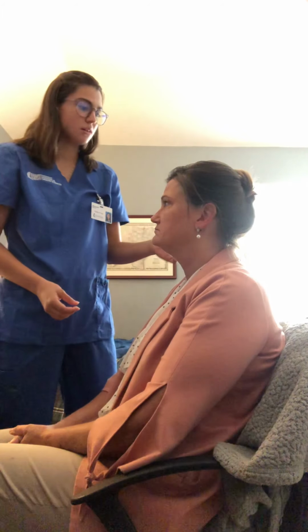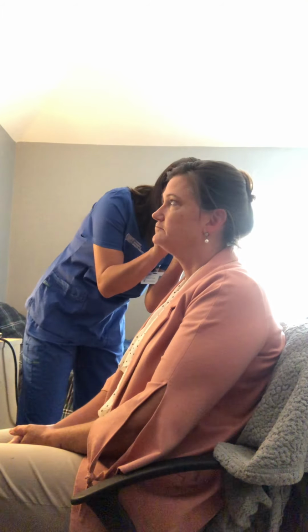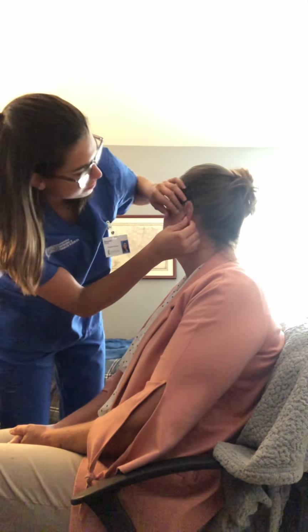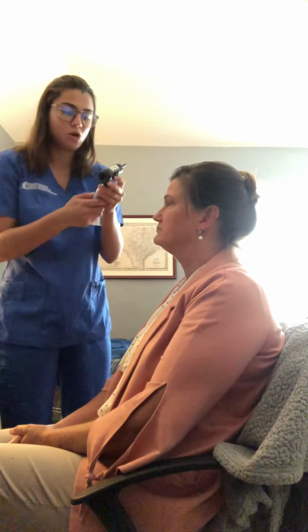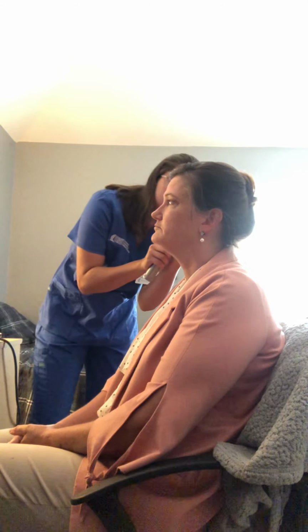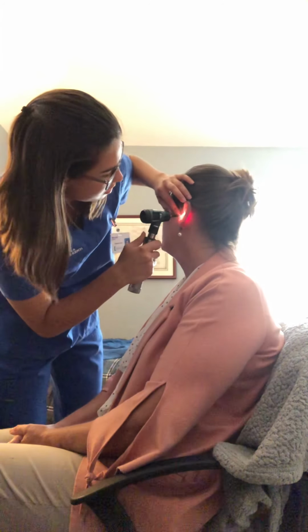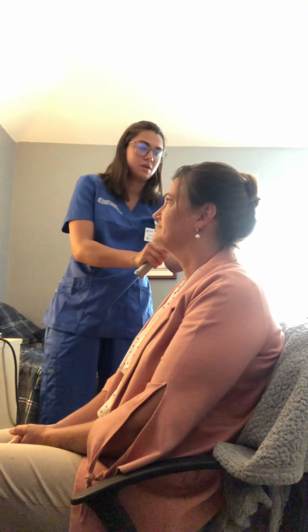So let's go ahead and take a look at the external auditory meatus, which is the ear canal. And I can go ahead and use the light on my otoscope to look at the ear canal here, checking for redness or any bumps or swelling, any abnormal growths. Everything looks clear and uniform.